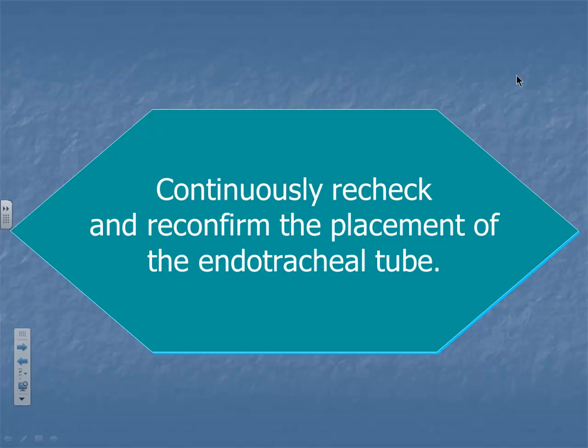So that's displaced. What does O stand for? Obstruction, yeah. They may have gotten a loogie on the end of that tube and it won't clear. Is that gross? Good. All right, what does the P stand for? You would think that, but that's not it. What do you think the P is? If you overinflate your patient, give it the two-hand squeeze. What does it stand for? Pneumothorax. That's right. So you want to check to see if you've got a pneumothorax. Maybe that's your problem here.